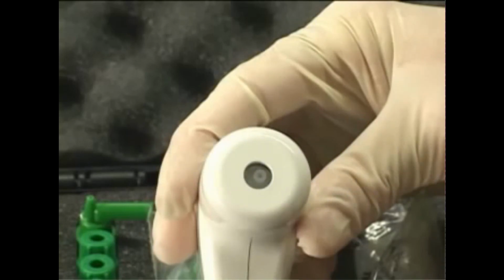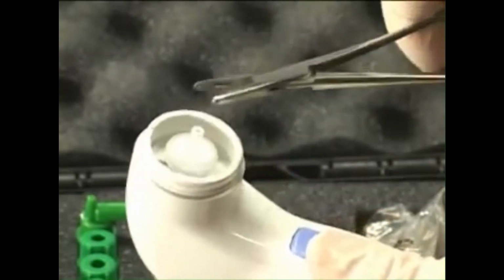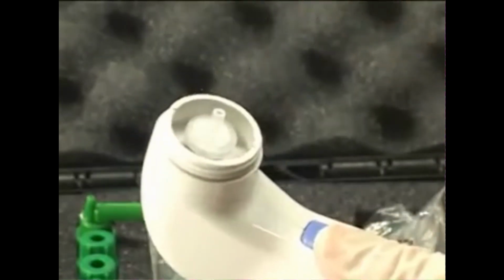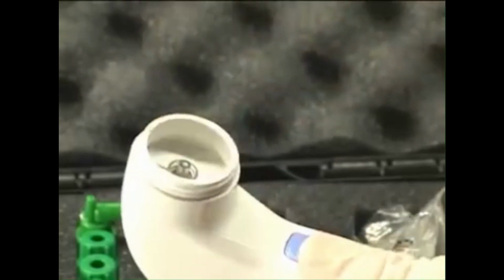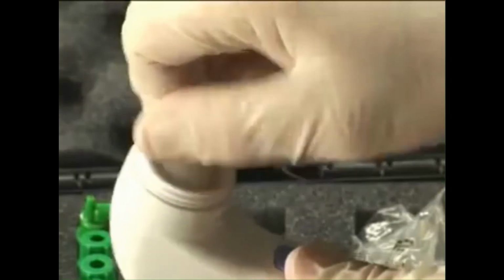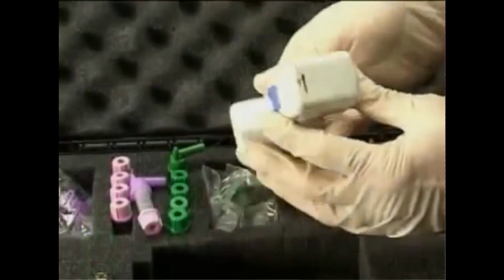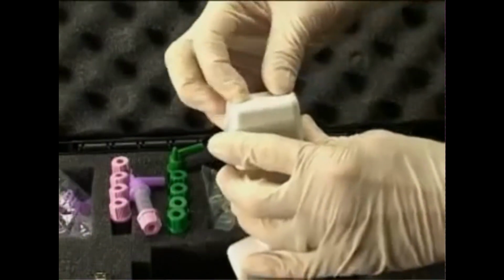Unscrew the round cover by turning counterclockwise and remove the filter by turning it counterclockwise. You can use forceps or something similar to grasp the filter to make it easier to remove. Replace it with a new filter and tighten finger tight. Replace the round cover on the Inovac. The Inovac operates on a standard 9-volt battery and is easily installed.